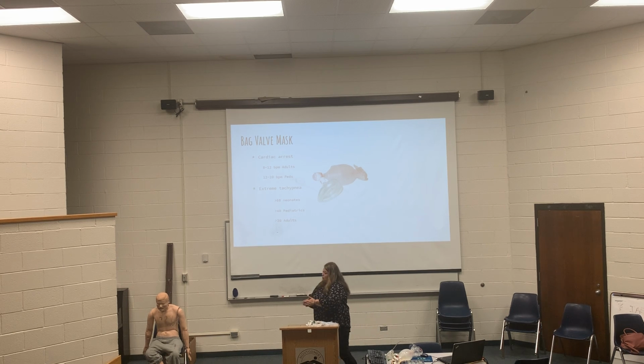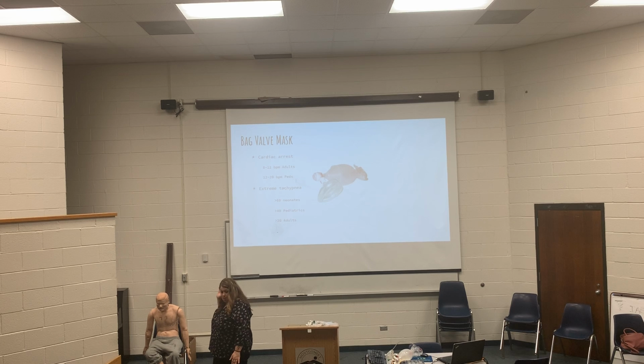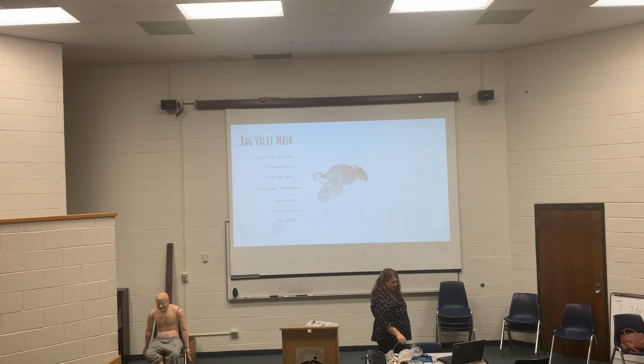So, what's the normal rate for adults with bag valve mask? 8 to 12. Yeah. Why do we say 8 to 12? Think back to your CPR stuff. What is the ratio of compressions to breaths? 30 to 2. 30 to 2, right.